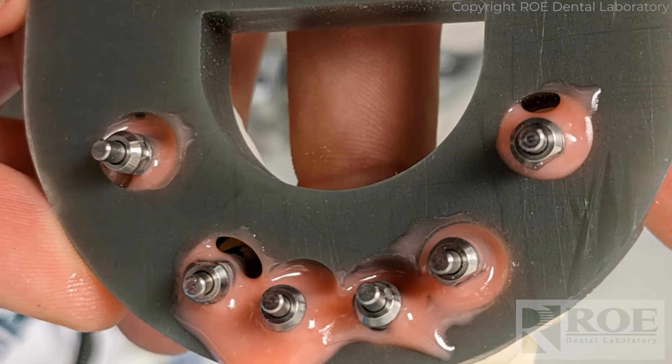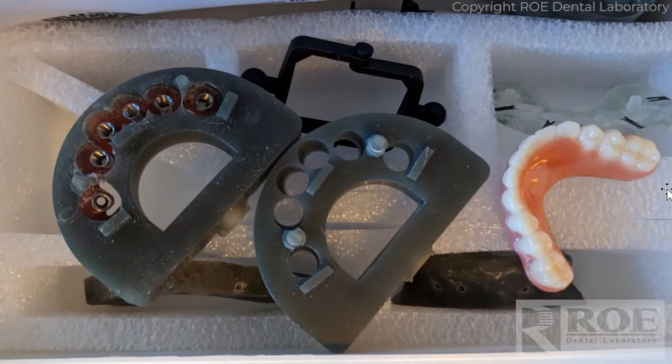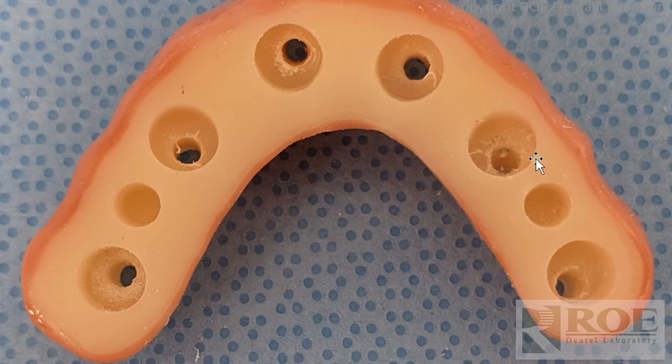Then we put the take-home prosthetic on the model and drill the holes. As you saw earlier, the C2F prosthetic has no holes — that's the lovely thing about C2F technology. We create the holes by drilling through them on the day of surgery, a pretty simple process. Now we have the holes drilled. You can see the accuracy of chrome: this was where it was planned, right in the middle, and this is where the implant ended up — very accurate.